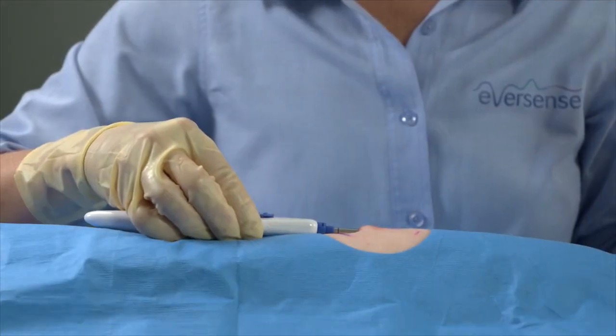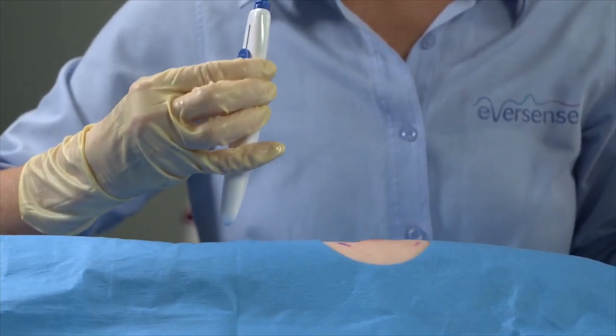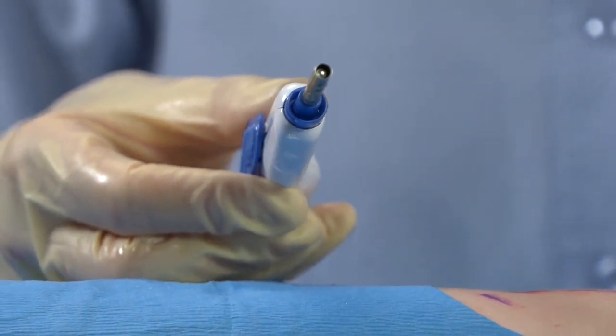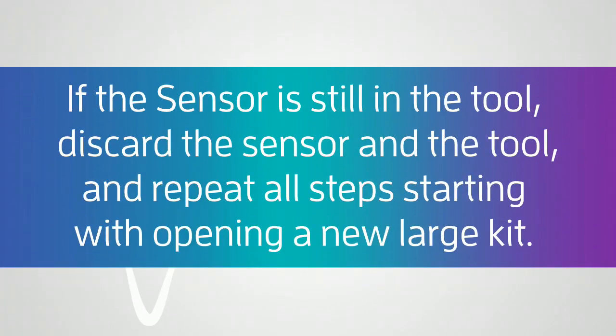Now you may remove the insertion tool from the incision. Visually check the end of the tool to ensure the sensor is not still in the tool. Then return the tool back to the tray. If the sensor is still in the tool, discard the sensor and the tool, and repeat all steps starting with opening a new large kit.